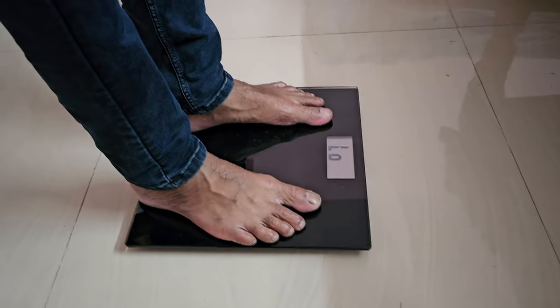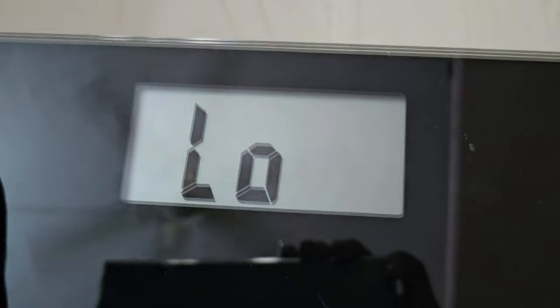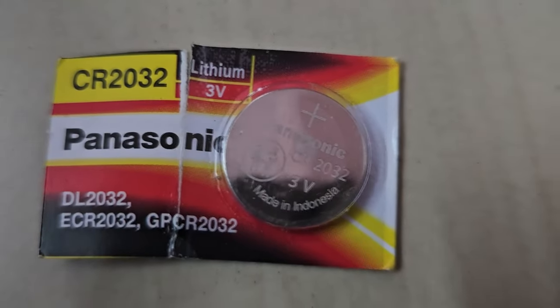In this video, I will show you how to fix the LO error on a digital scale. The error is due to a low battery. If your scale displays this error, please replace the battery with a new one.